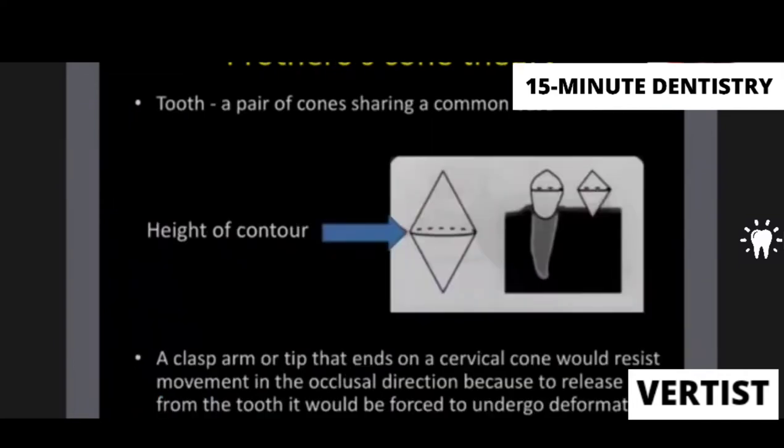Prothero's cone theory, very important again. So it's a pair of cones which share a common base. That's your height of contour, and that's what is important. The Prothero's cone theory is something, if you want a cutting edge in your answers, you need to mention these terms.